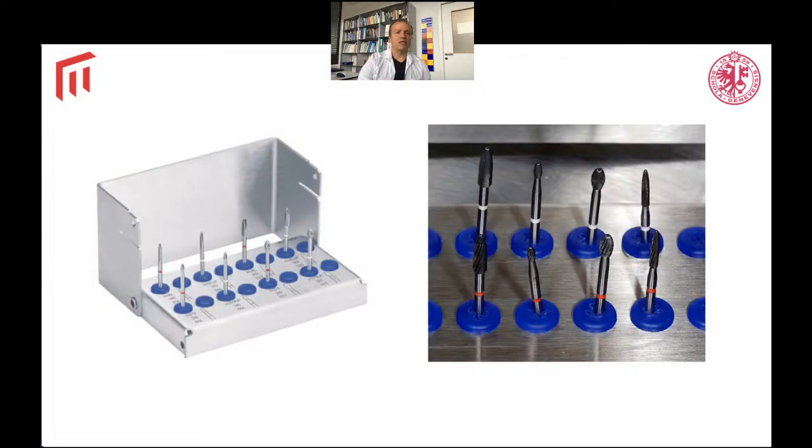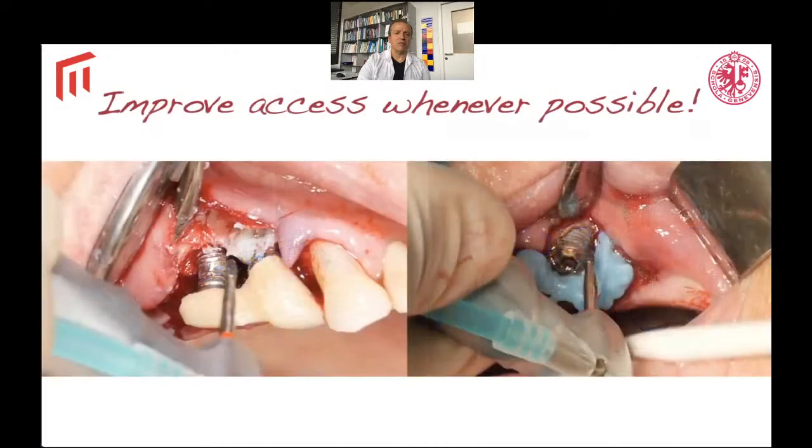We use a specific kit of burrs to do the implantoplasty. There are different producers out there. I do not have any specific agreements with any company, so it's just to illustrate to you that you have different burrs with different configurations and different cutting capacities in this type of sets.